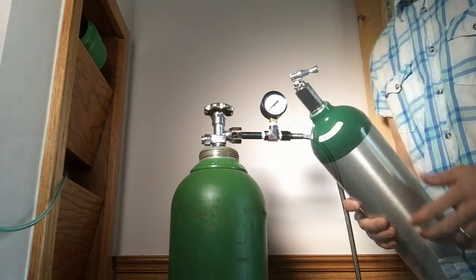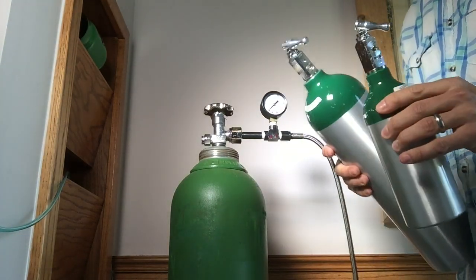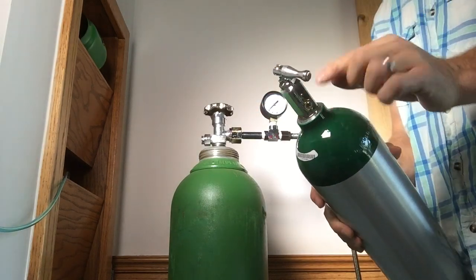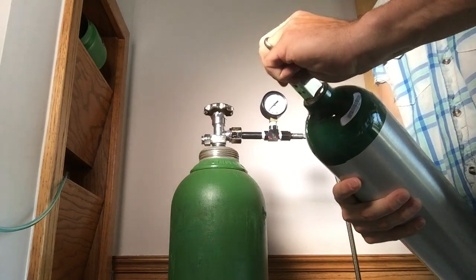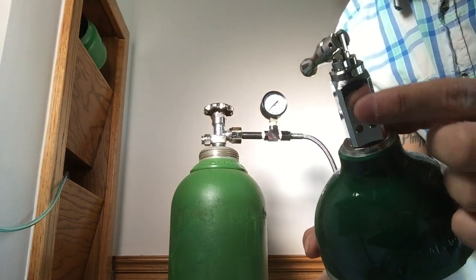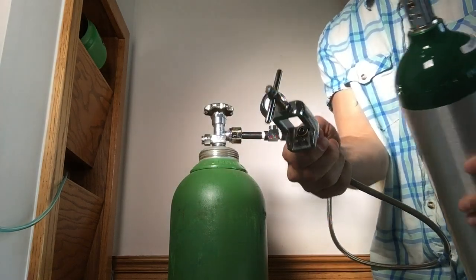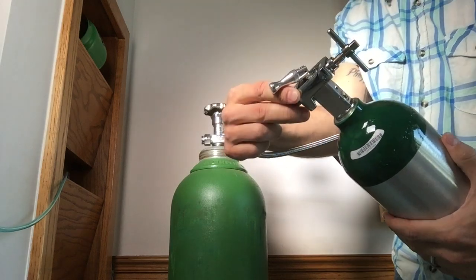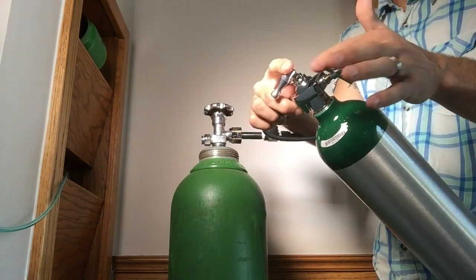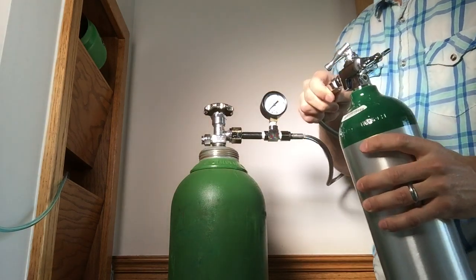Now we'll go ahead and connect the other side to our medical tank. I have two medical tanks here — a D tank and an M4 tank. They both have the same connection, and all medical tanks really do. They've got a stem, and ideally you'll have a toggle valve on the top to open and close the valve on the tank. There are a couple of holes where we're going to connect our 870 connection from the transfill hose. I'm going to slide it over the head, feel those two prongs slide into place, and hand tighten it down into its slot.